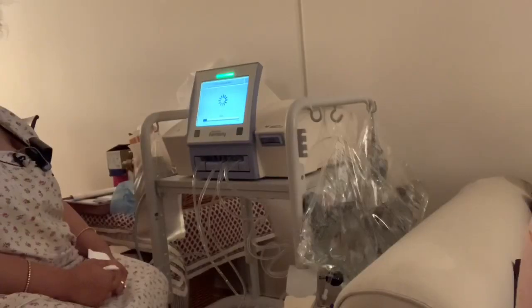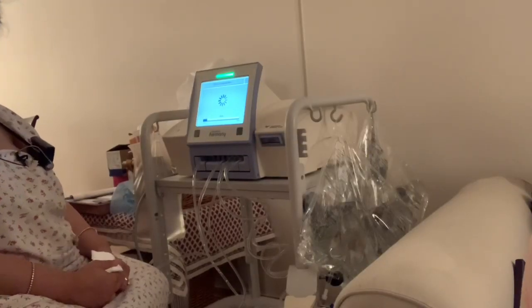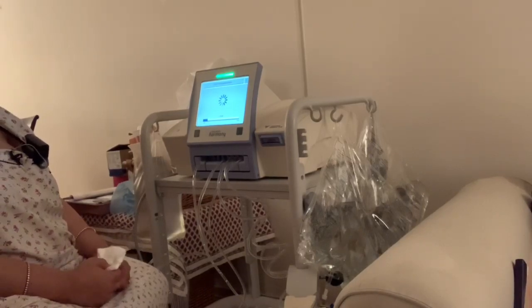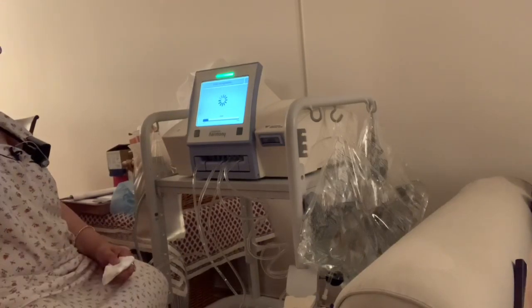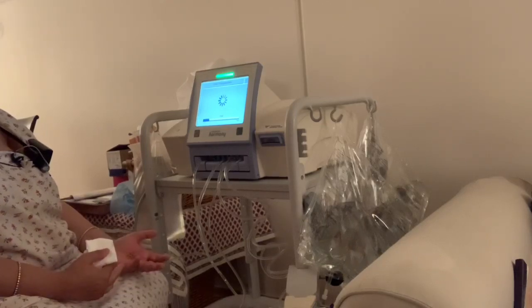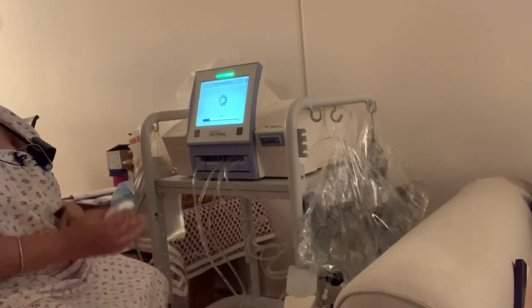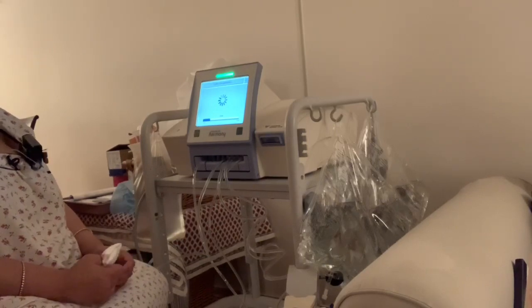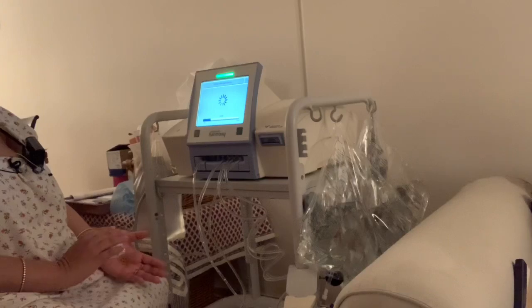We normally try to get it done by 11 at the latest — between 10:30 and 11. By 7 o'clock in the morning I get to disconnect. This whole process has actually taken 14 minutes and we've only done half of it; the full process would take a good 20 minutes, or up to 20 to 30 minutes total.